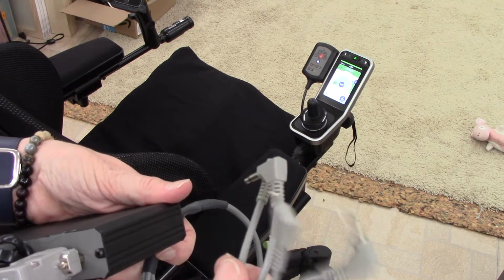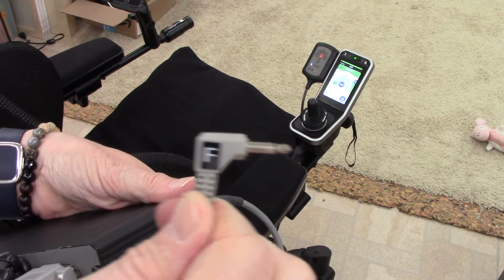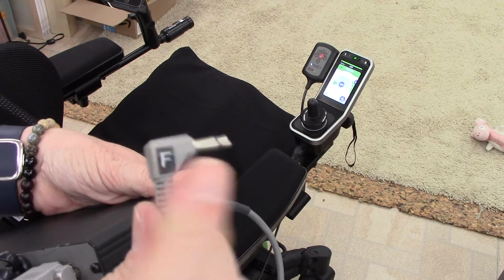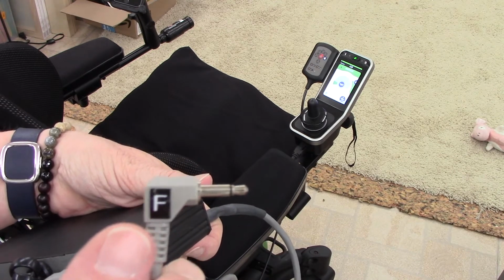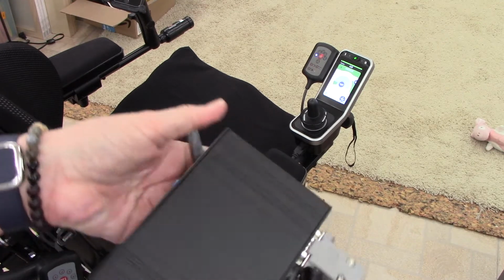Okay, I'm going to take the one that says forward, or F, and I'm going to plug that into my communication device, because that's the switch that I'm going to use to scan on my communication device when I show you. All right, I'm going to quickly show you the other side.